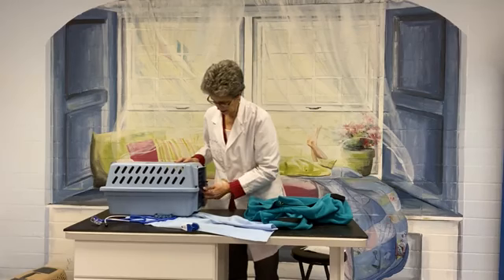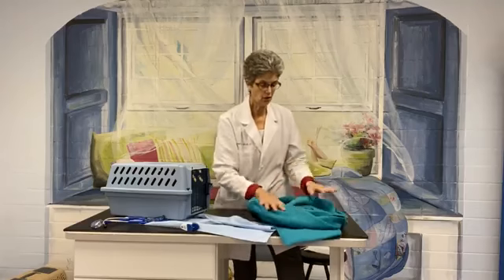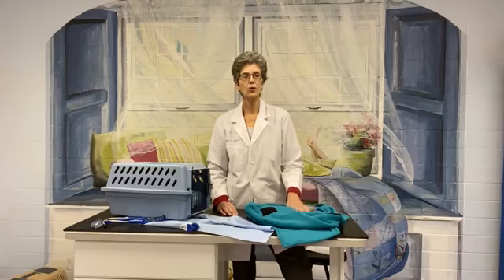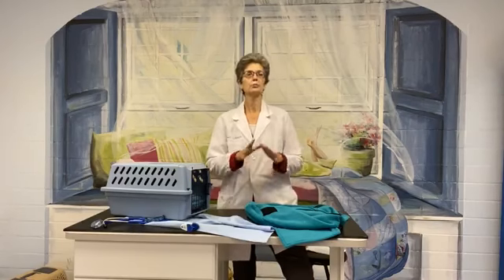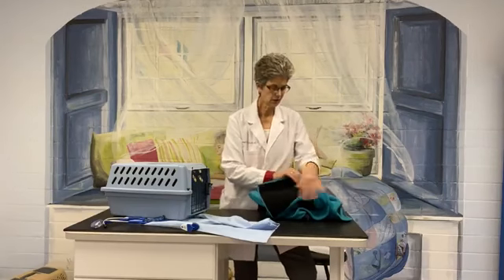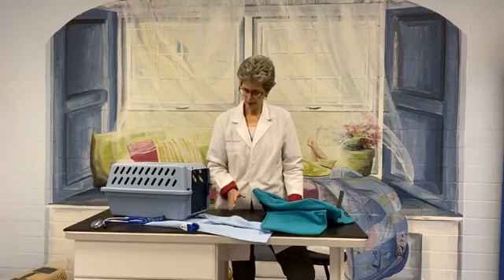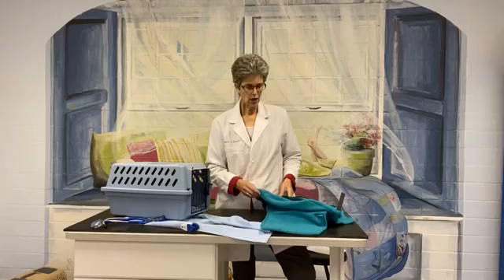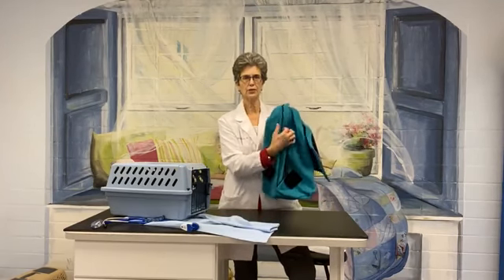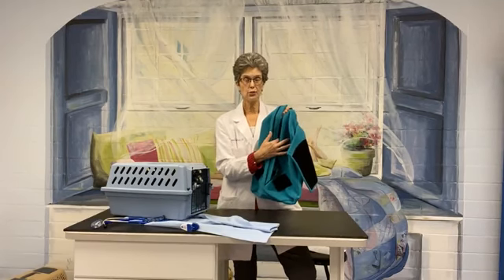Now for home use, I would definitely recommend keeping this out, laying it open to be like a cat bed. The more this is scented with that cat's own scent, the better they're going to like laying in it or being wrapped up in it. At home, of course, you may not need to do as many of the different points as we need as a veterinarian. If you have a diabetic cat that's difficult to give the injection to, you could quickly wrap them in this. You could just unzip the neck a little bit if you're going to give the injection over the back of the neck, or sub-Q fluids that way.